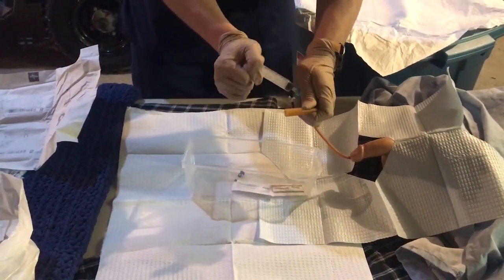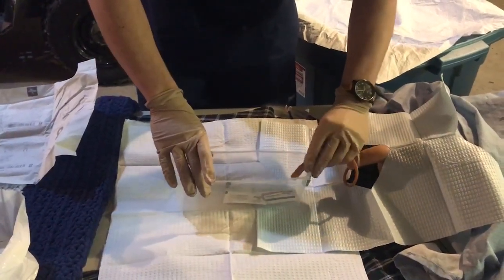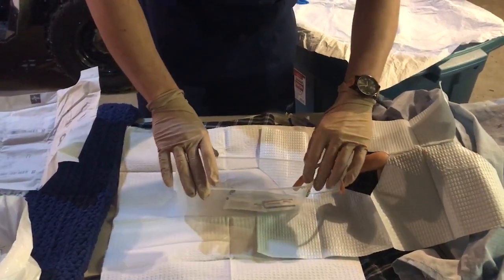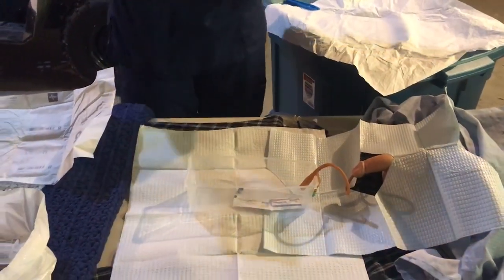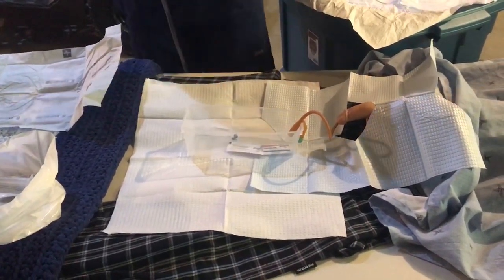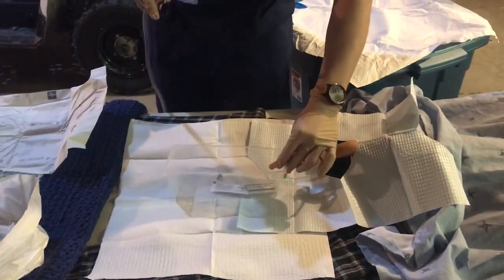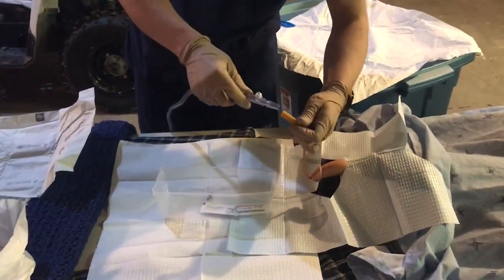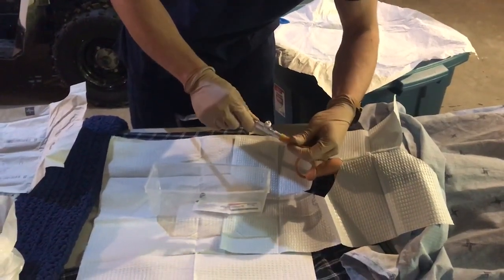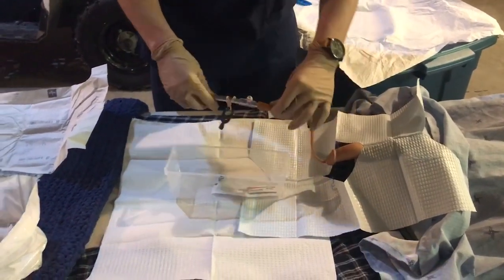I'm going to remove the syringe, throw that in the garbage, and place my catheter on the edge of the boat there, like so. After that, I'm going to get our tubing for the drainage bag, remove the cover there, and maintaining sterility, I'm going to attach it to the catheter. Make sure that it's good and on there.